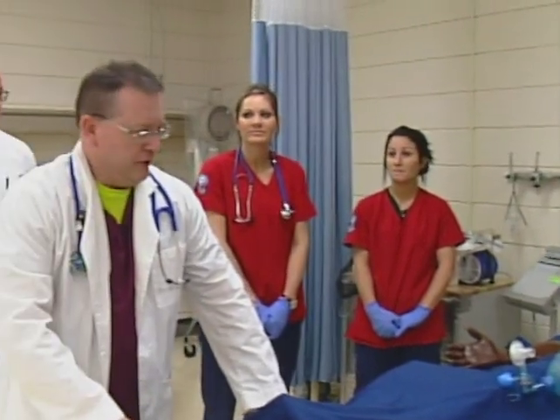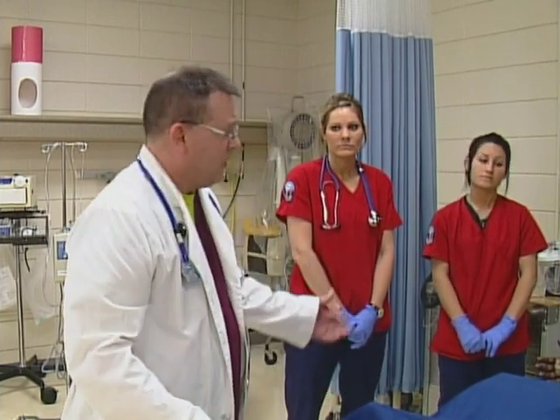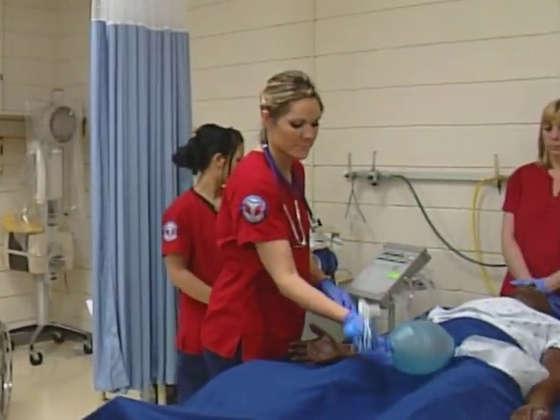There are a lot of reasons why we would possibly want to intubate a person. Primarily, it's because they can't protect their airway, and we need to provide an alternative artificial one. The person may be comatose due to a drug overdose. They may be under severe respiratory failure. At this time, we're actually going to proceed to do this demonstration of the procedure.